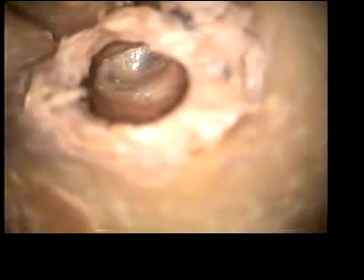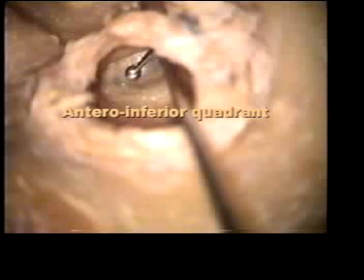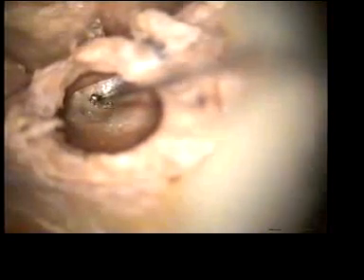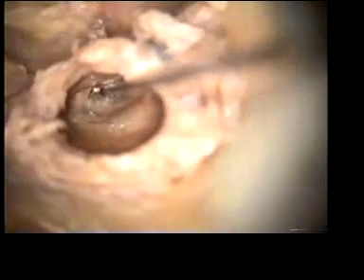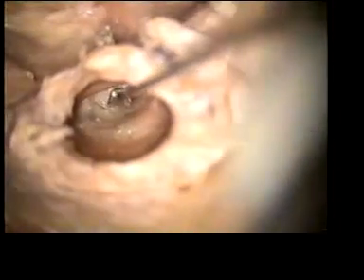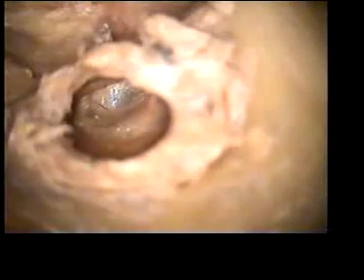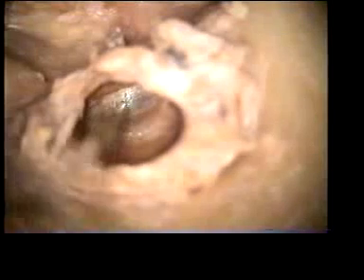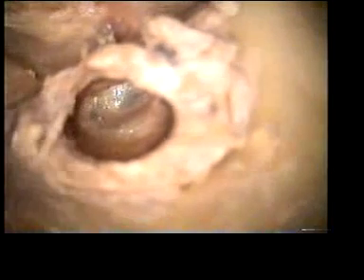The grommet or ventilation tube is commonly inserted in the antero-inferior quadrant. A radial incision is made using a myringotomy knife at the antero-inferior quadrant. The incision should not be very close to the annulus, because if it is very near to the annulus, the grommet tube or ventilation tube will be extruded very fast.